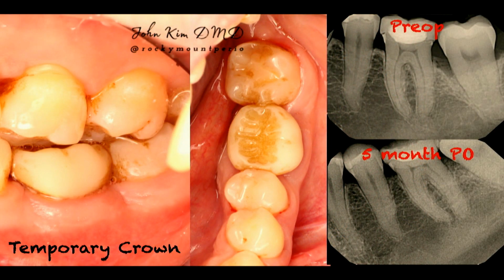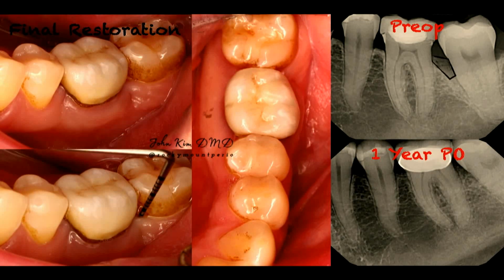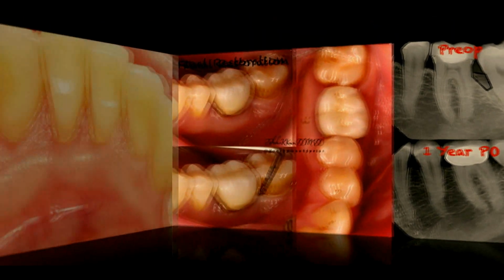And 5 months out with the temporary crown in place, tissue is not inflamed, got good bone fill, cleared this tooth to get the permanent restoration, probing depths have improved, no bleeding on probing, and we have good bony fill of the infrabony defect with a simple GTR procedure using BioXclude.